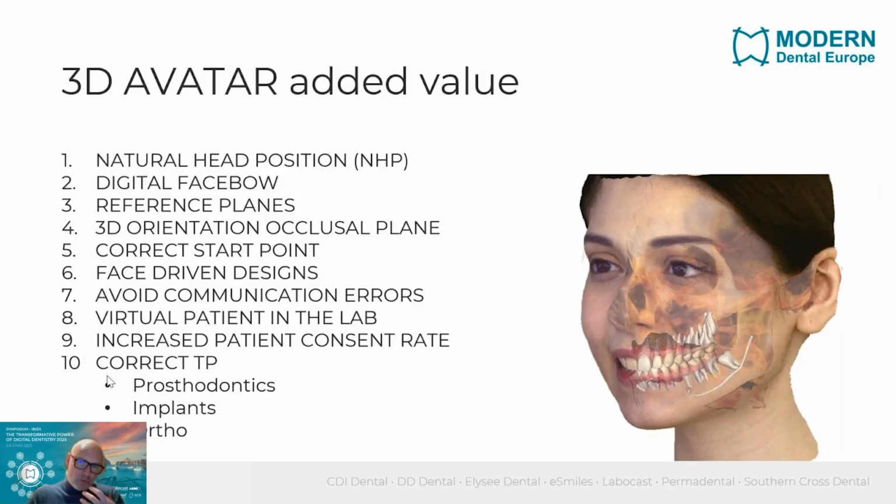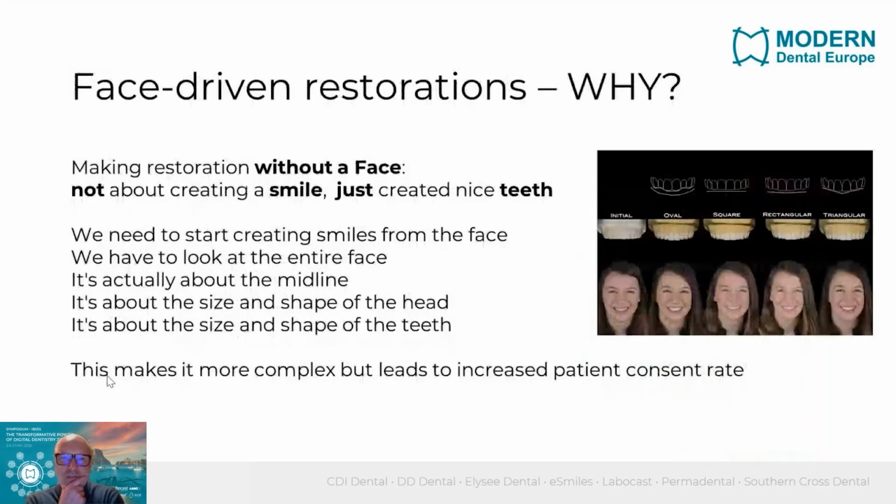So of course the smile design will fit the patient better, more individual, and this will also help the patient actually, in the end, agree with the treatment plan. So: correct treatment plans, more predictable treatment plans for different indications, prosthodontic, implant work, ortho, or combinations.